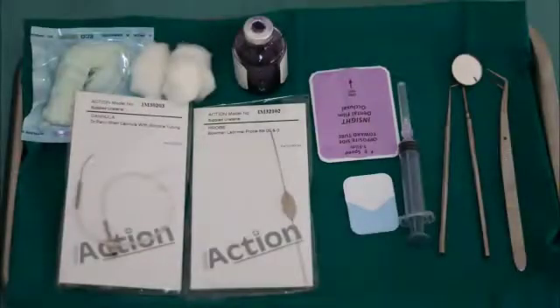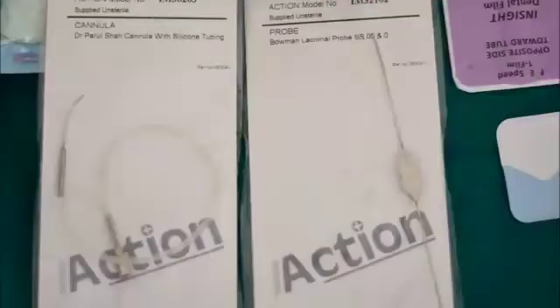Let's start with the list of armamentarium required. We have a mouth mirror, probe, tweezer, syringe, occlusal radiograph, intraoral periapical film, cotton, contrast media, lacrimal probe, and a cannula.